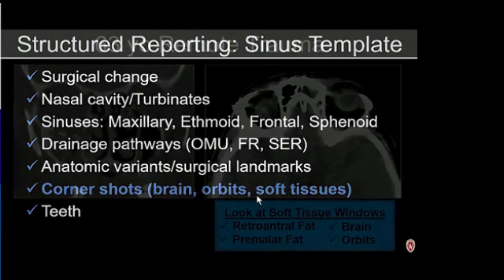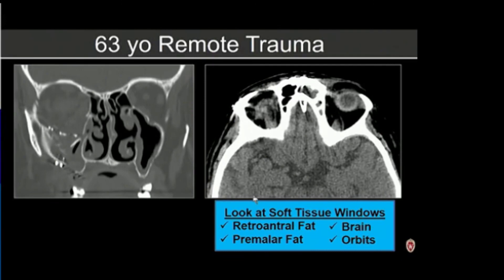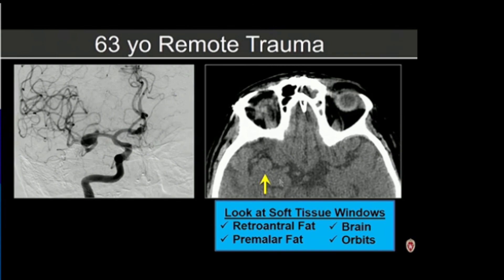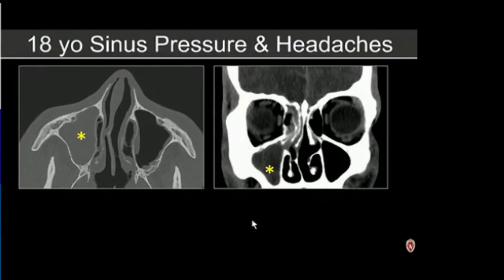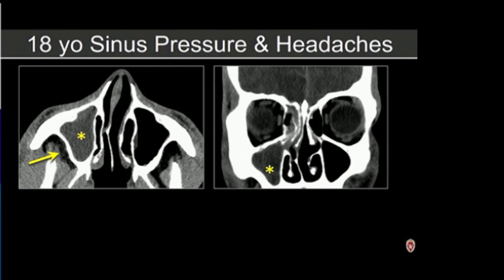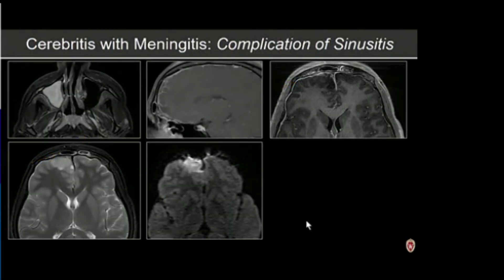A few important corner shots to finish: always review soft tissue windows for incidental findings and regional structures. In a 63-year-old with remote trauma and a ZMC fracture repair, always look at the brain — in this case a round structure along the M1 segment was confirmed to be an aneurysm. When evaluating sinus disease, look at regional anatomy carefully: opacification of the maxillary sinus with infiltration of the retroantral fat and low attenuation in the anterior-inferior frontal lobe with a small focus of gas, confirmed on MR as cerebritis with meningitis — serious complications of sinusitis.